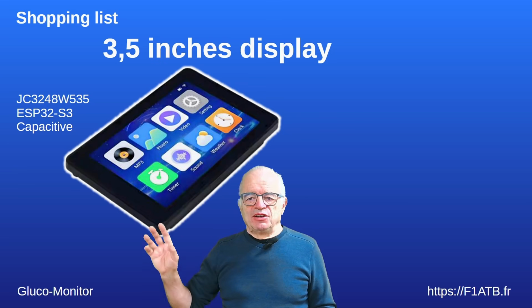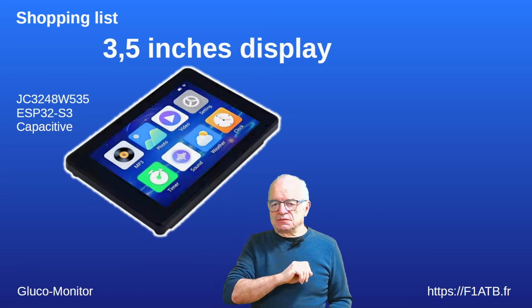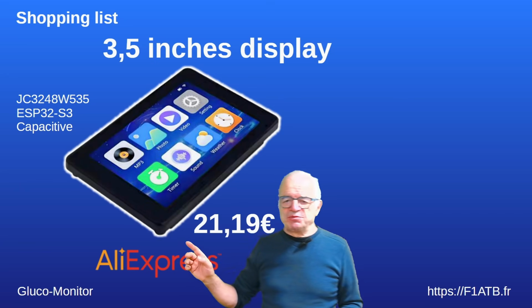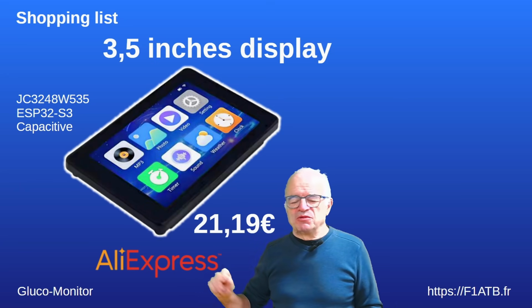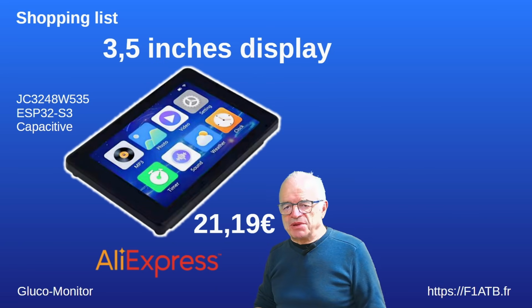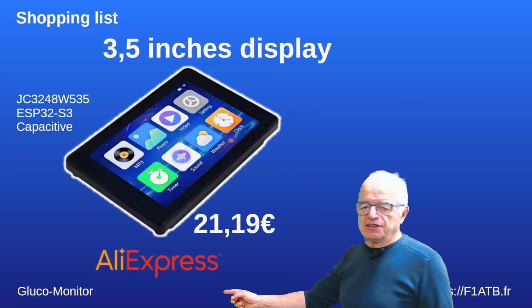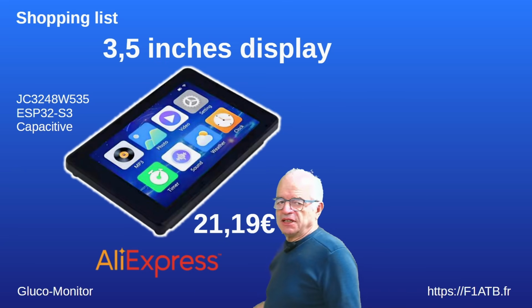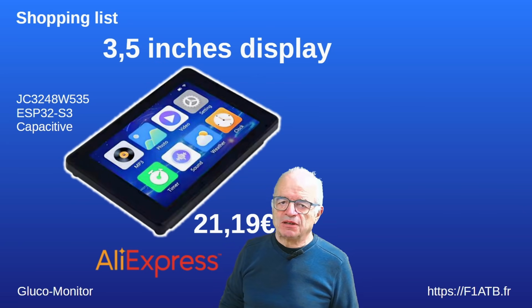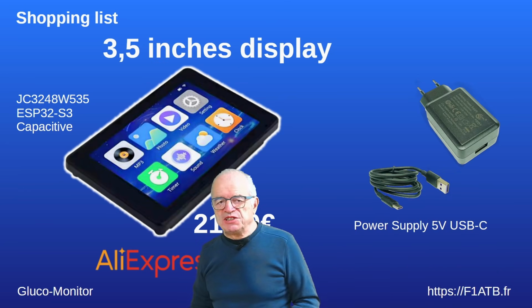The shopping list. You just have to buy this screen, which is a 3.5 inch display. You can buy it directly in China because this is a China design based on the ESP32 processor, which is a very powerful processor, which is capable of Wi-Fi, Bluetooth, and has a good processing power. And so this system is at a very low cost, you can buy it directly on AliExpress. You have to wait 10-15 days, but it works perfectly and you will receive it well packed. Like we use for any smartphone, we use a USB-C connector.